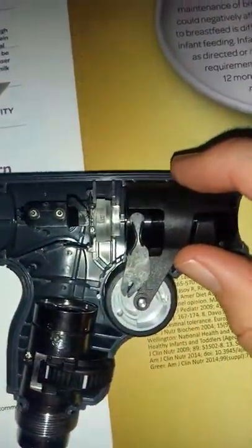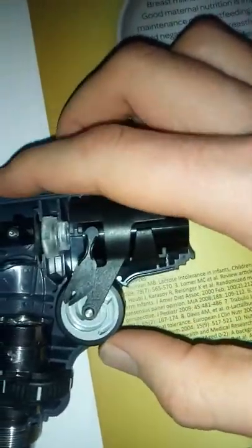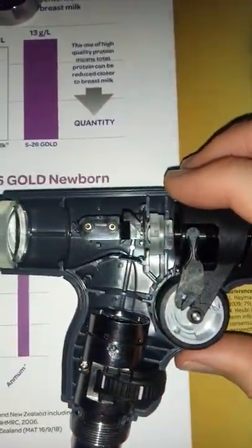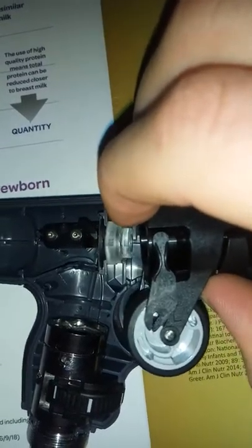And in here, this is the moving mechanism. The first time this one was opened, it all fell out and fell on the floor, and it took a long process to figure exactly how it fits back together. So I'll show you how that works in just a moment. When you pull it out, it tends to fall apart. Take careful note of how it's positioned.